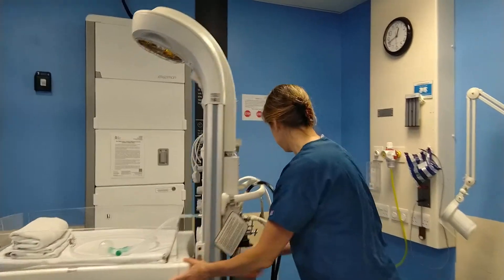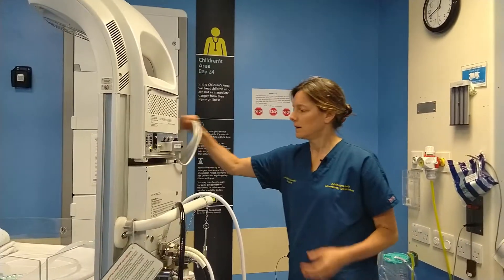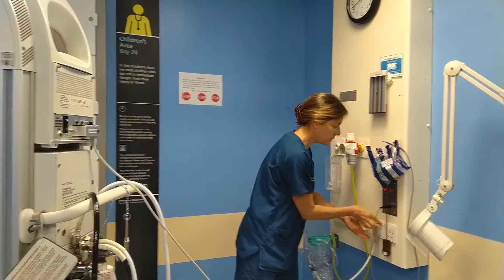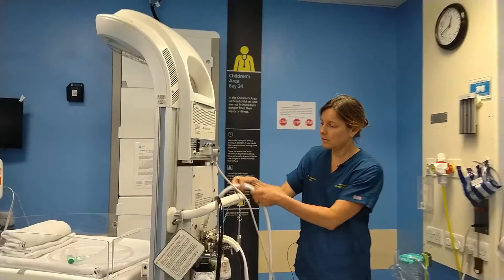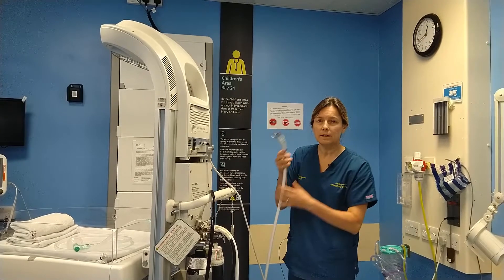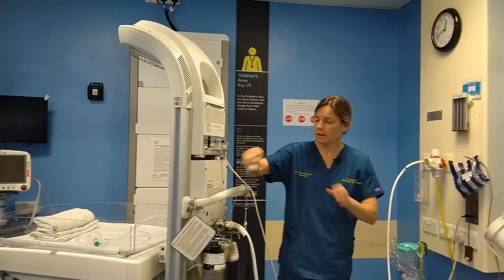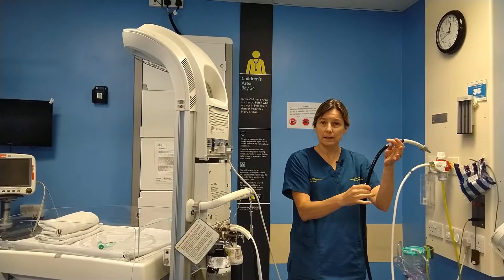We'll look at the back of the machine. First of all you want to plug it into a wall socket and make sure that it's switched on. You then want to make sure that you plug in the oxygen to a wall oxygen port, and you'll want to plug in medical air.